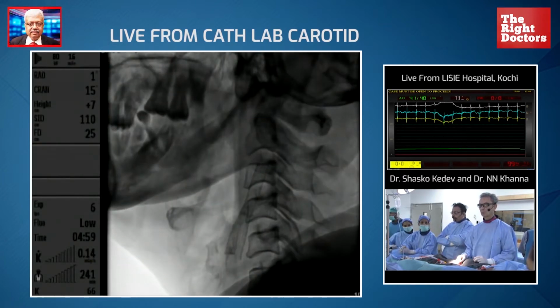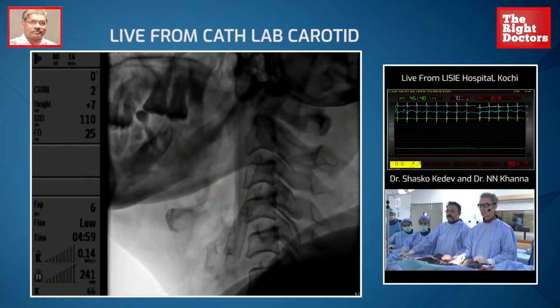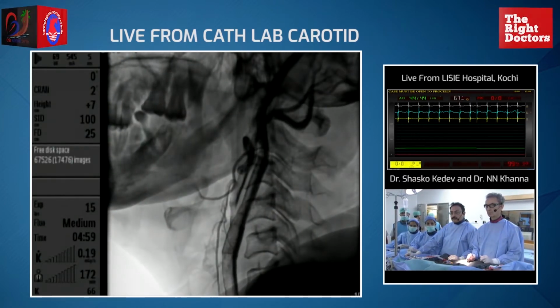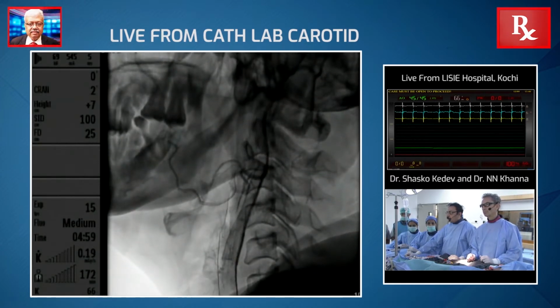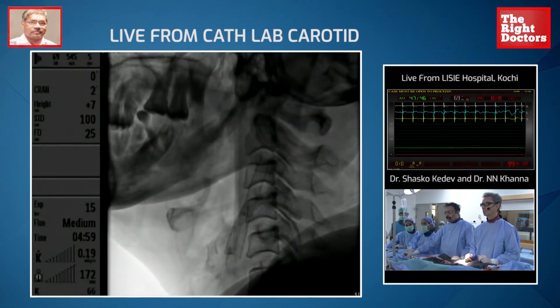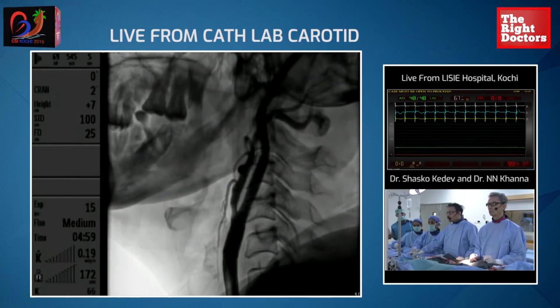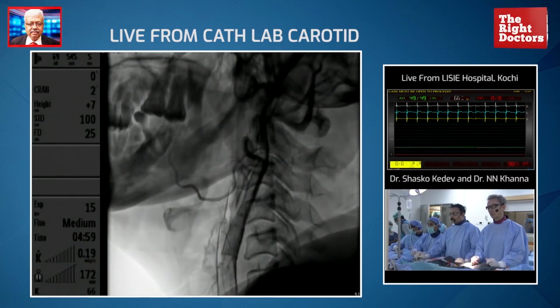It's always very important to do a mini neurological examination at the end of the procedure. Sometimes we give them a ducky and they keep pressing on the ducky and you can hear the voice. But looks quite fine. If you have any questions, we can answer that. Thank you. I think it was well done. We worked with bradycardia and then super bradycardia when you balloon. There was just a transient bradycardia of a few seconds, which is a very normal phenomenon. And if you don't post-dilate beyond 5 millimeter, usually it's not a persistent thing. Yeah. When you were post-dilating, I was looking into. Yeah, but this is one thing that I think we ought to be aware of, that this bradycardia can occur. And sometimes it's a little more than transient at times, so you need to be a little careful about that. Do you have any point?